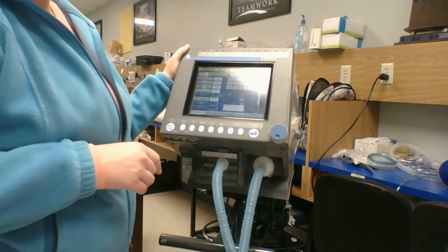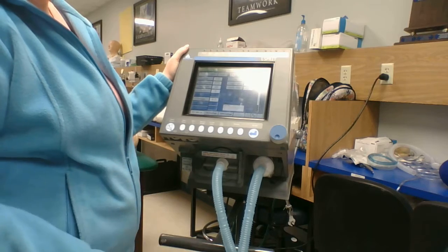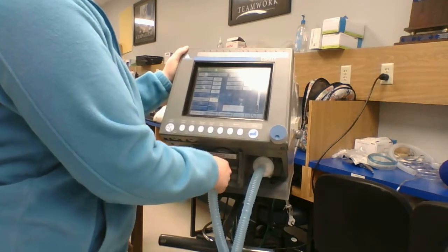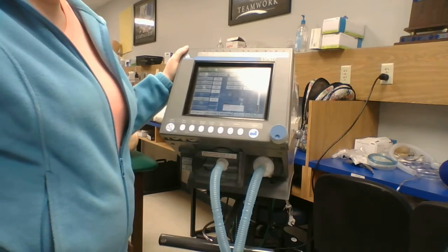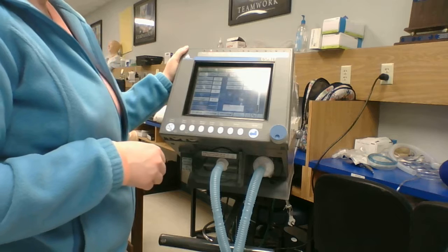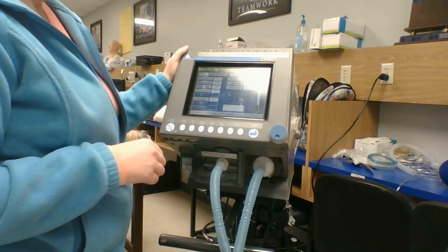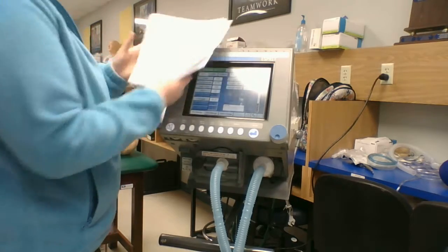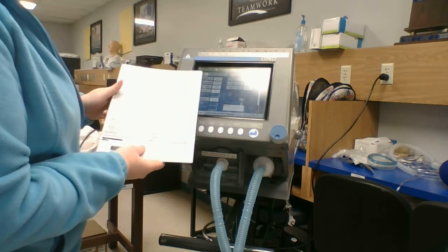I'm going to check my patient, I'm going to check for any leaks in the circuit, make sure everything's connected right. I'm going to start with my patient and then I'll work back to the ventilator, making sure that everything is set properly.